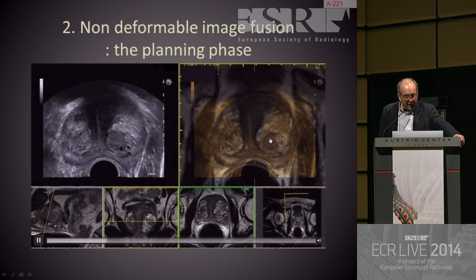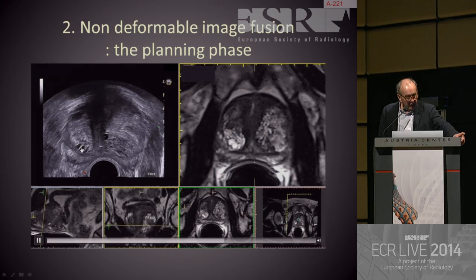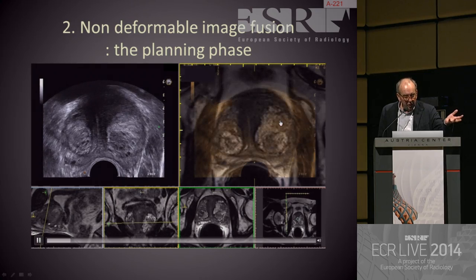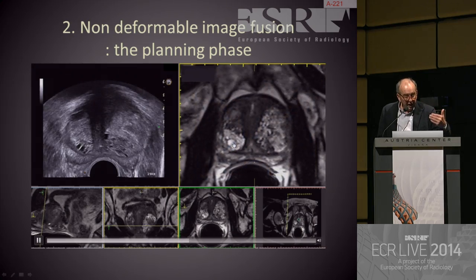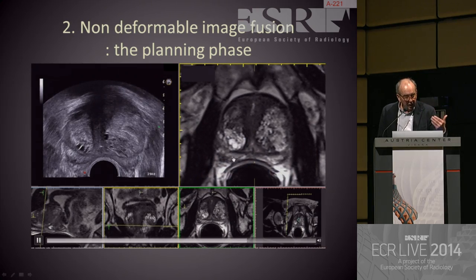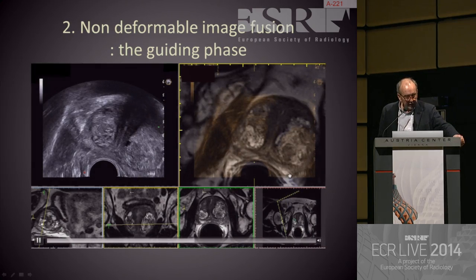And then when you activate, you see that these tiny cysts can be overlaid with this tiny cyst, and this large one. Okay, you're satisfied with the overlay because you can see that the internal landmarks can be overlaid during scanning, and then you can do the biopsy, as shown by Bernd. The target is virtual because you don't see or barely see it on TRUS, and you activate the biopsy again to sample the prostate.